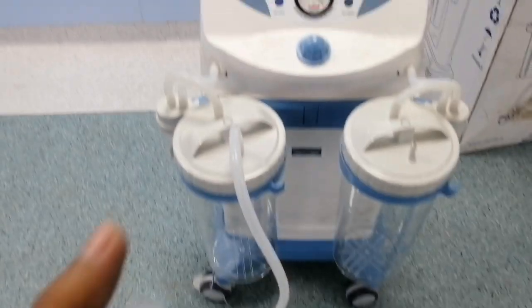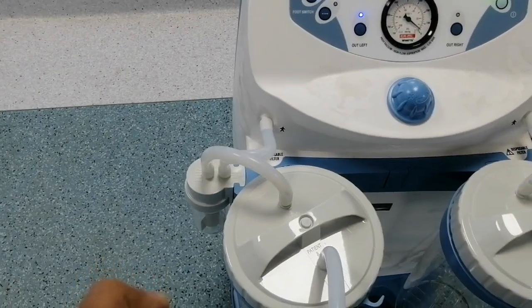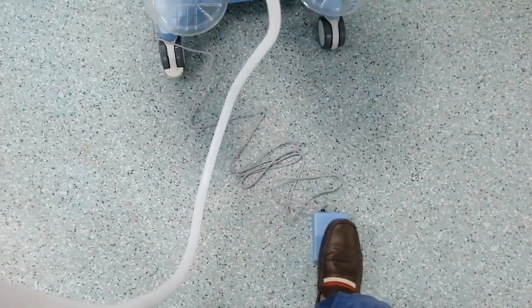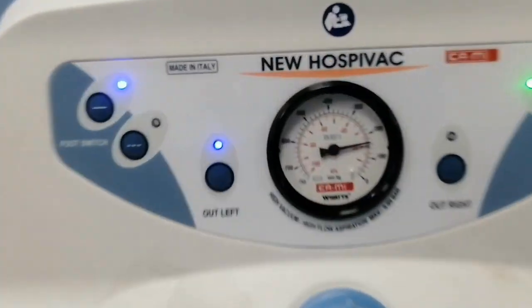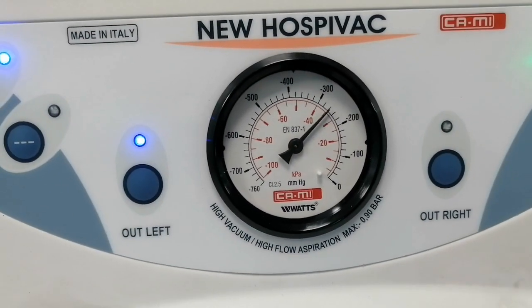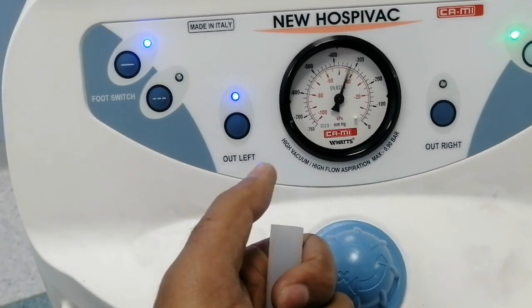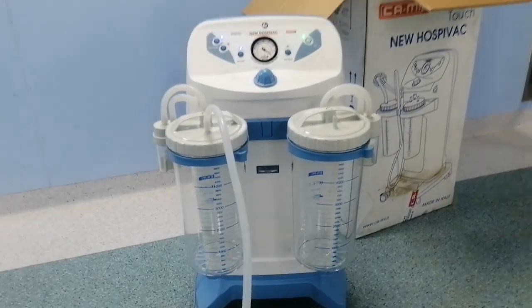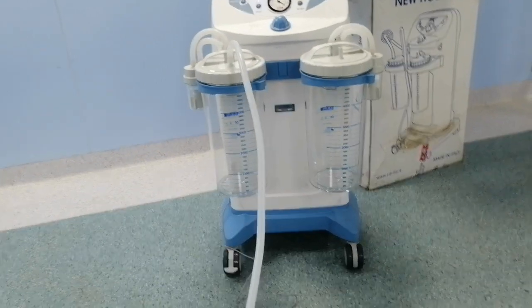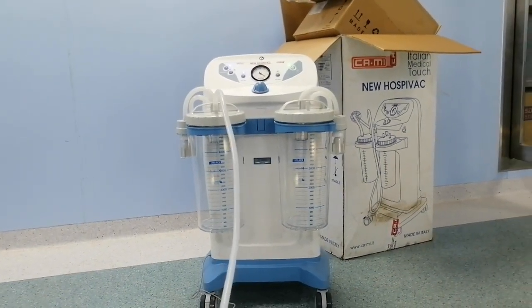When we press the switch, the machine operates and creates vacuum on the bottle system. After pressing the switch, the machine begins suctioning and the suction jar fills to the required level as per suction. This is the complete procedure and operating guide for this suction machine. If you have any questions, you can ask in the comment section — thank you very much for watching.